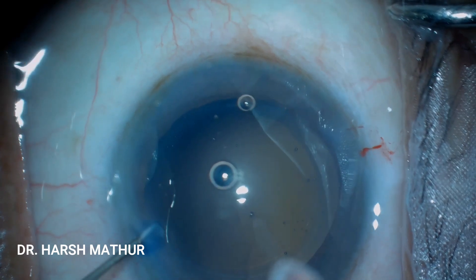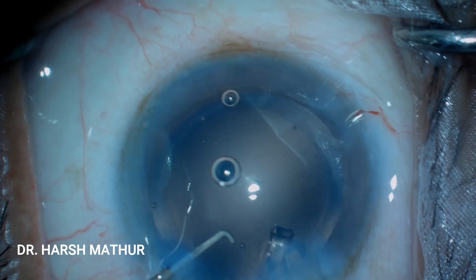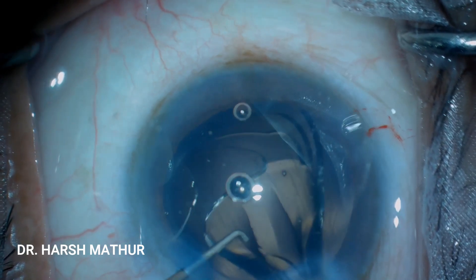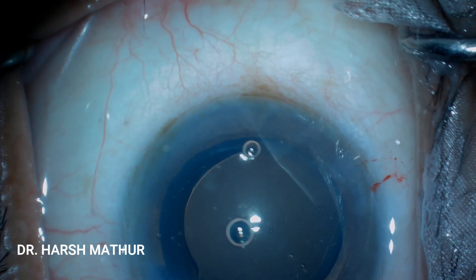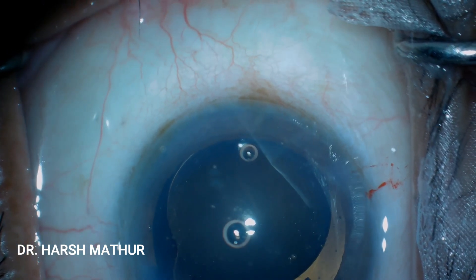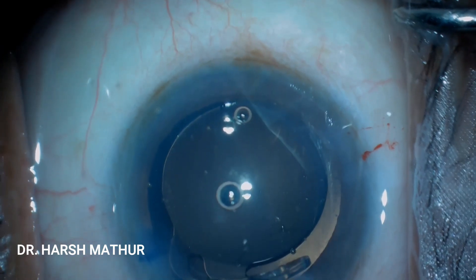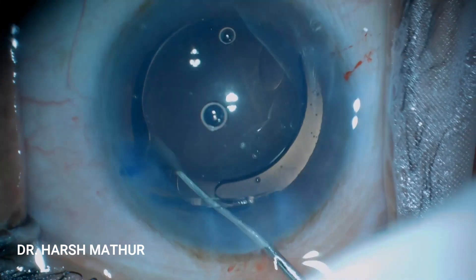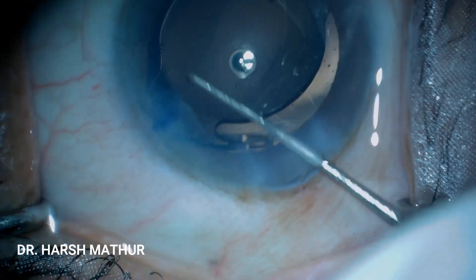Coming back to the opposite clear corneal incision — the only disadvantage is that there might be an under or over correction, because this technique depends upon the healing properties of the patient. Young patients heal differently from older patients. Generally, when we place opposite clear corneal incisions temporally they correct about 0.5 to 0.75 diopters of astigmatism, and when placed superiorly they correct approximately 0.75 to 1 diopter of astigmatism.